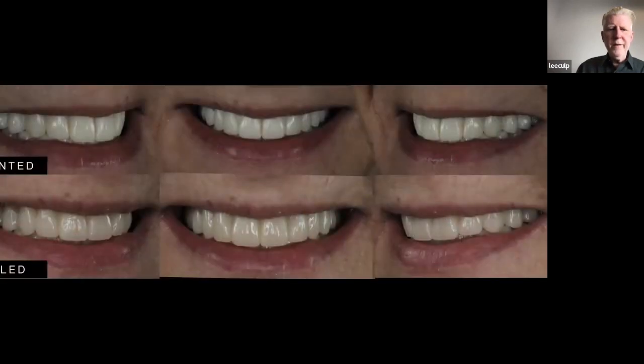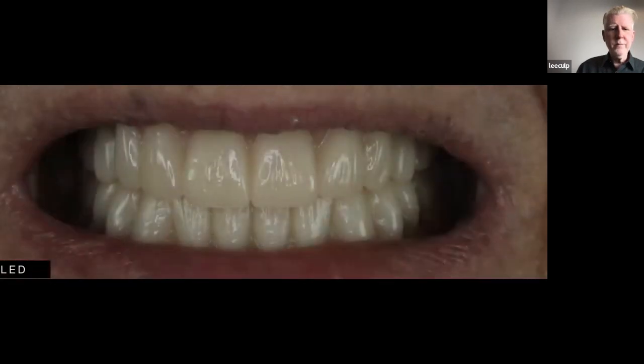And again, the printed teeth in the mouth looked a little better on the photography, but still very opaque teeth. And then milled teeth. So the milled teeth today are actually pre-layered. They have a gingival color, neck color, a body color, and an incisal color. So they match the shade guides, and the regular denture teeth, actually very nice.